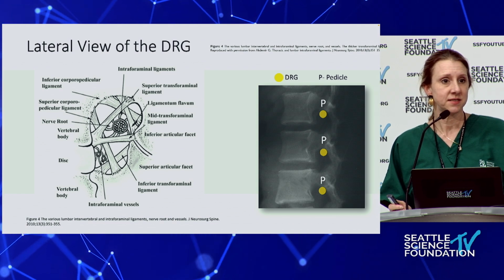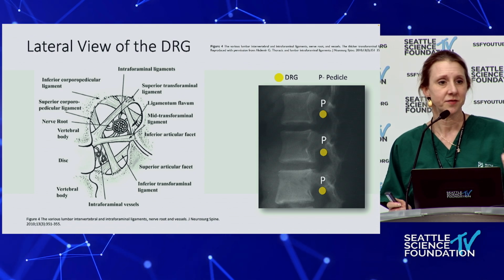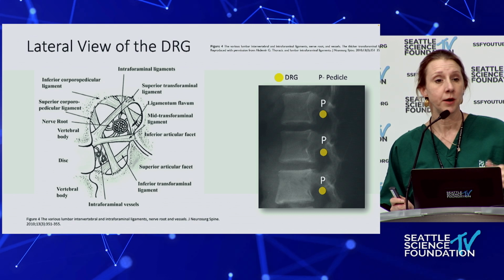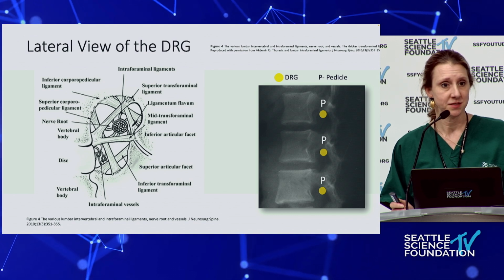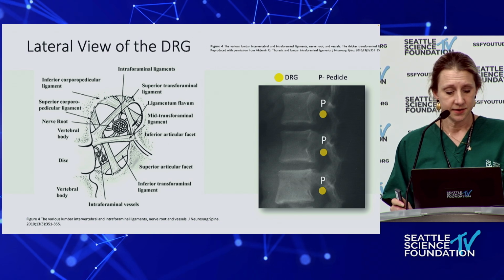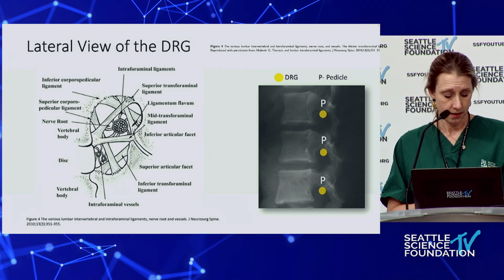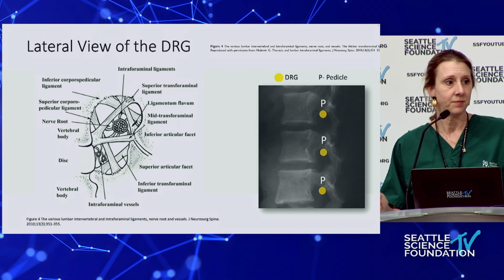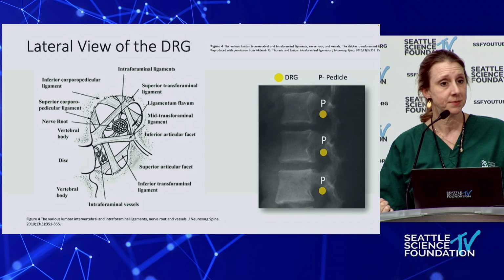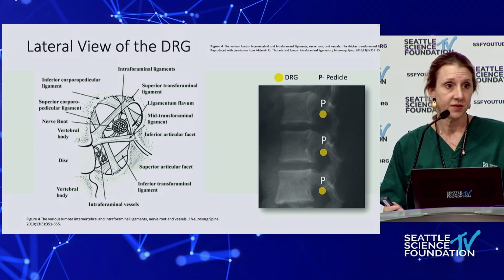I mean, we place transforaminal needles to do epidural injections, and there's a lot of reasons we explain to ourselves why the contrast may or may not flow subpedicular and into the lateral recess, but I never quite understood until I saw this picture. It is a really complex area, and when you see me in the lab in a moment, I may be lucky enough that the lead just slides right between those little ligaments, and then there's times that it doesn't. This is the explanation for that.